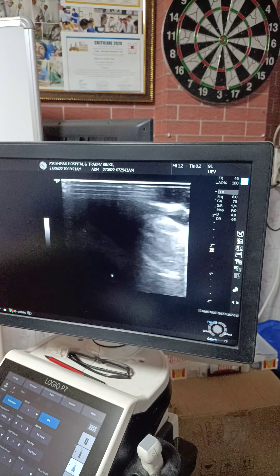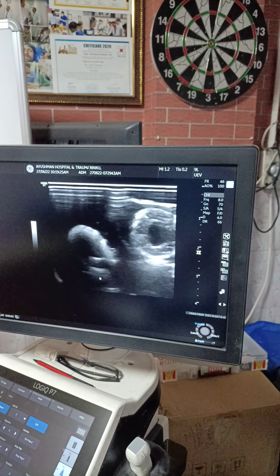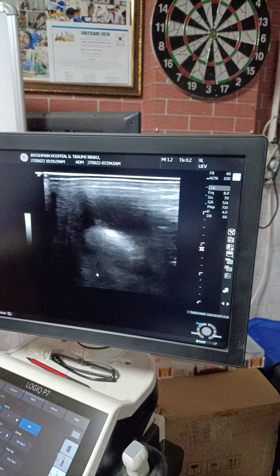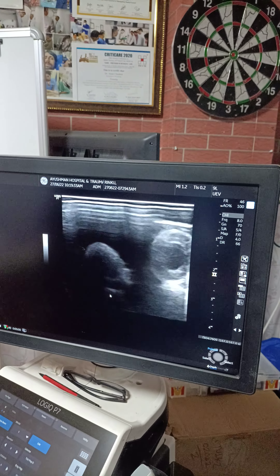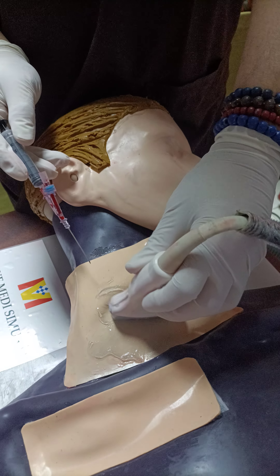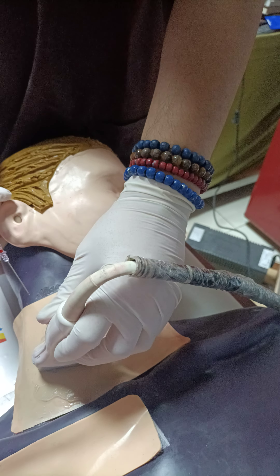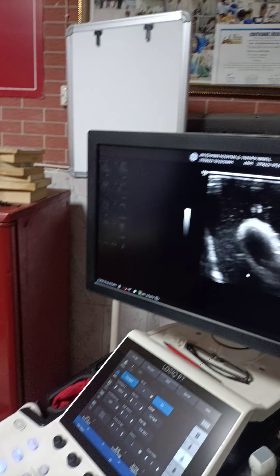What is different in our simulator is that when you hit the vessel and your needle tip is in the lumen, you get blood back. Now, for the out-of-plane approach: once again this is the carotid — move laterally and you see the target vessel, which is the IJV. Now I will puncture the skin using the out-of-plane approach.